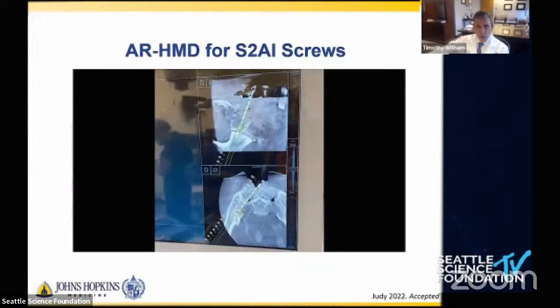So one thing I do want to point out on there, it's actually very difficult to video because you have to put the camera over the lenses of the headset. So we're still working out trying to show surgeons what the view actually is that you see. The view is actually better than was demonstrated on that video, but it's just the technical limitation of trying to video, put a camera through the lenses to see what's going on.